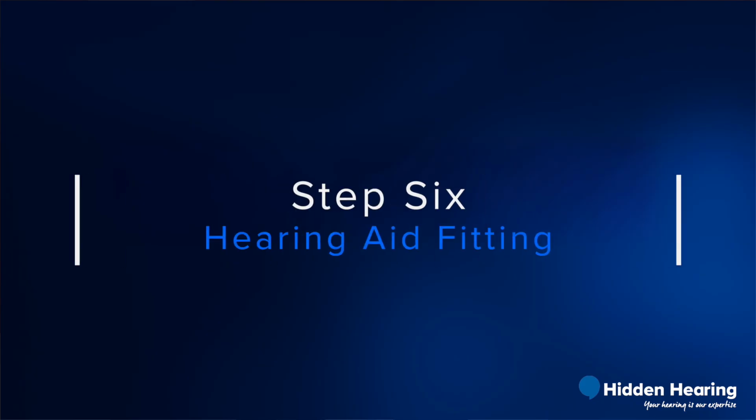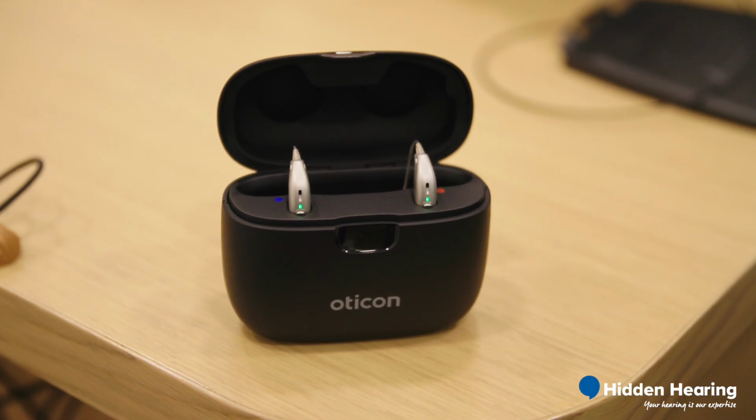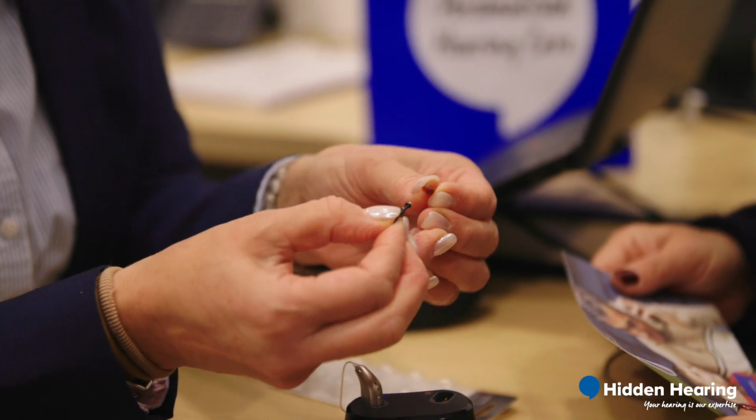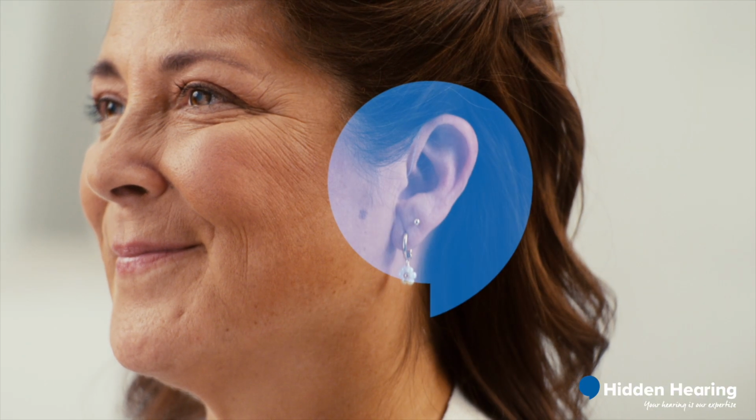Step 6 is the fitting of the hearing aids. When the patient comes back for that appointment, they are shown how to use the hearing instruments. They're shown how to maintain them, how to clean them, how to charge them if they're rechargeable hearing aids, how to basically care for them.